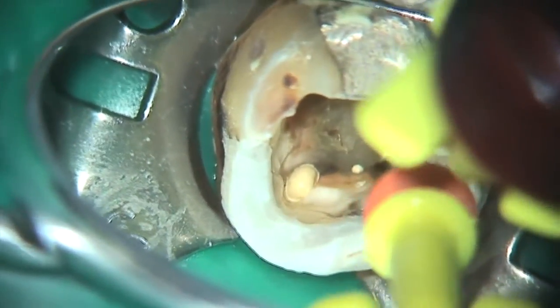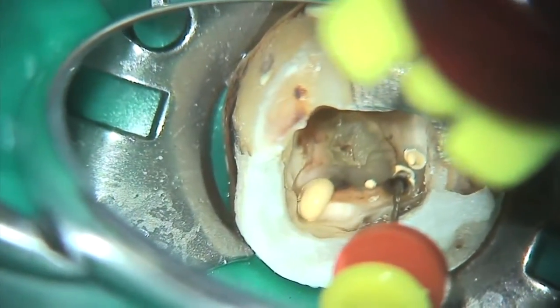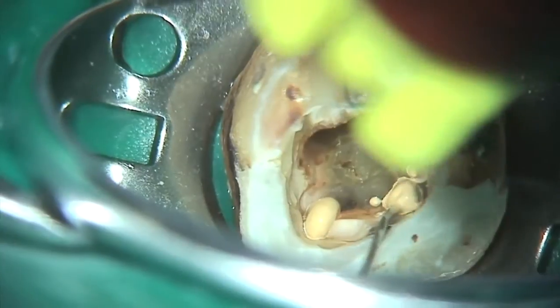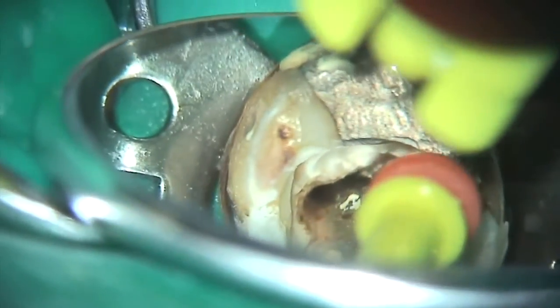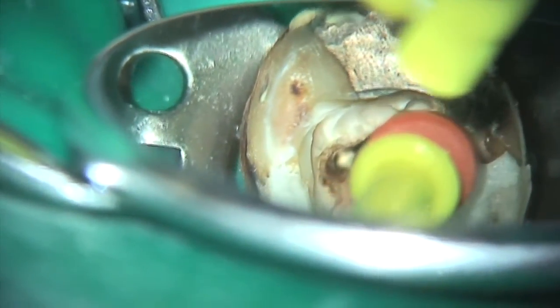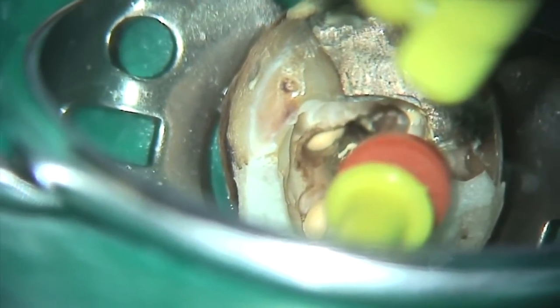I'm just going to show this video very quickly. This was one of the first teeth I ever did where I saw these anastomosis — filling the mesial buccal canal of the lower molar and watching it come up the mesial lingual of the lower first molar. Then I had the same phenomena happen in the distal canal, and it just blew me away the first time I saw this.